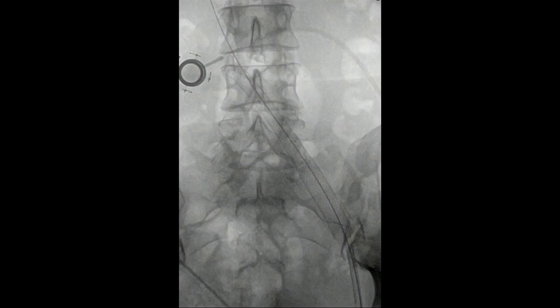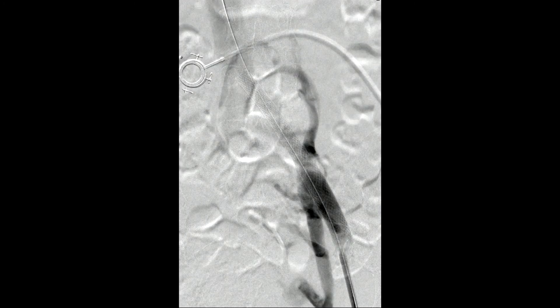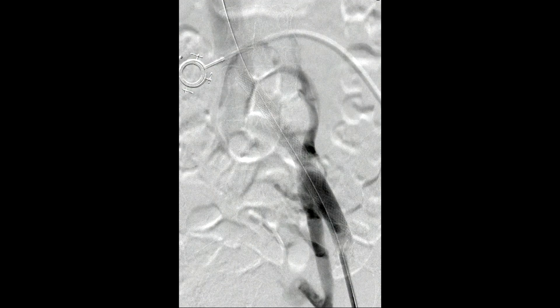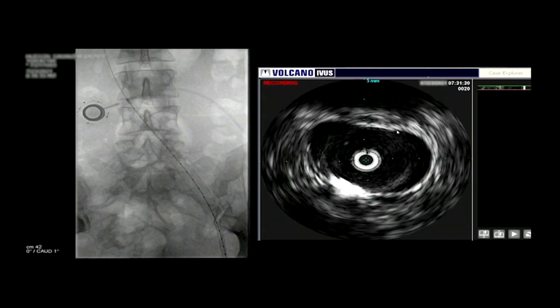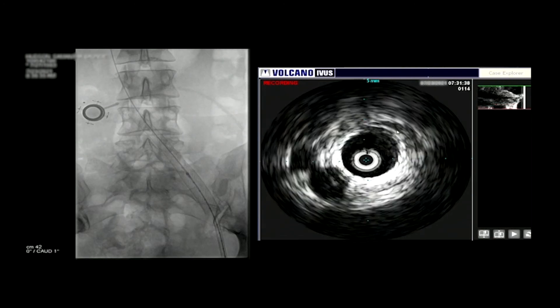We then used a series of balloons — we started off with a 12mm balloon, went up to a 16mm balloon, and then repeated the intravascular ultrasound. We usually start off right in the area of the compression first and foremost, then work proximally and distally. We came back in with a bigger balloon and dilated up to 16mm. After that, we performed the completion intravascular ultrasound. The maximum diameter was still only about 10 millimeters, but I was a little anxious about going much higher. Here is the final completion IVUS shown in the inferior vena cava — the stent is a little free-floating, nicely flows through the stenosis and it's become more proximal, again free-floating. We thought that was satisfactory and we terminated the case.